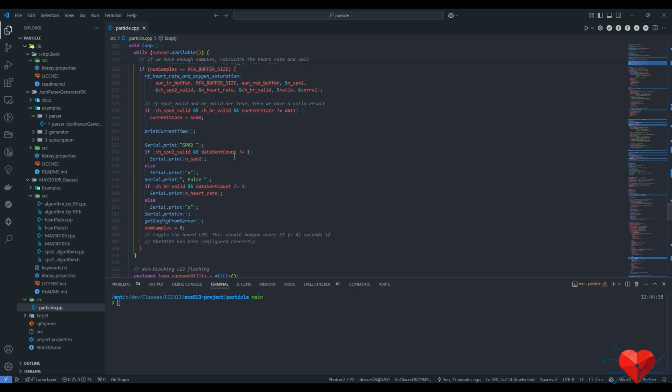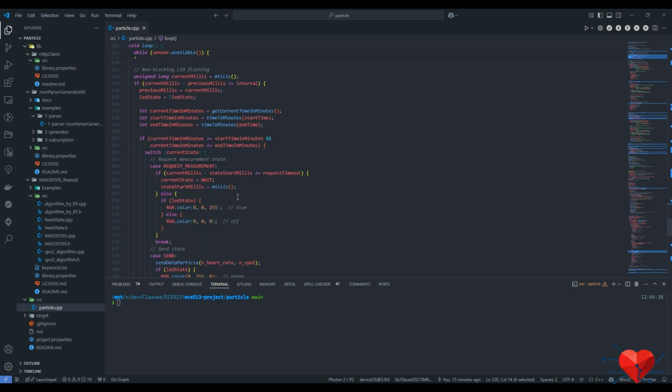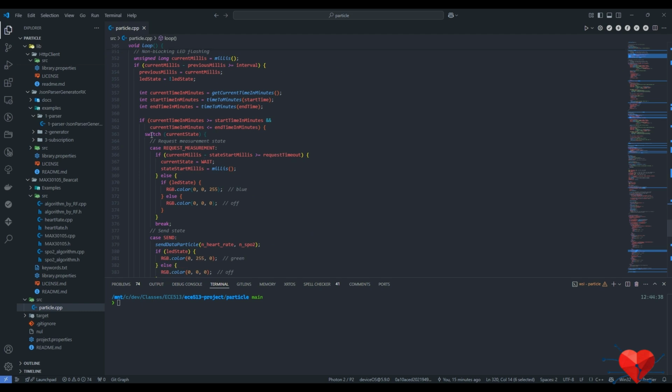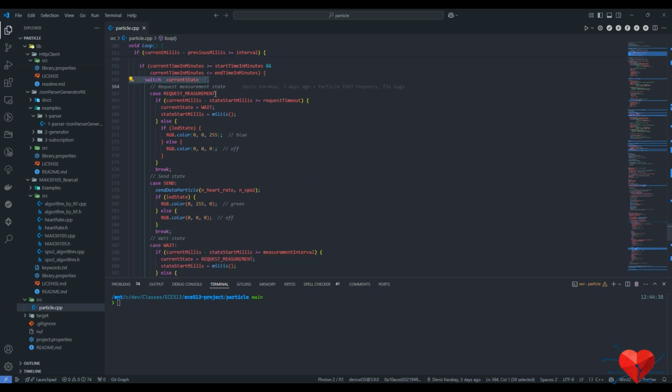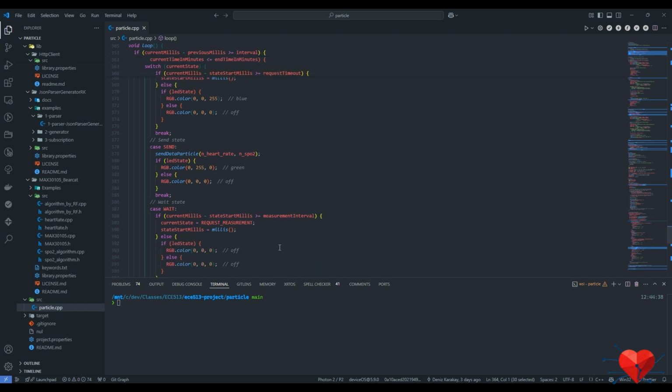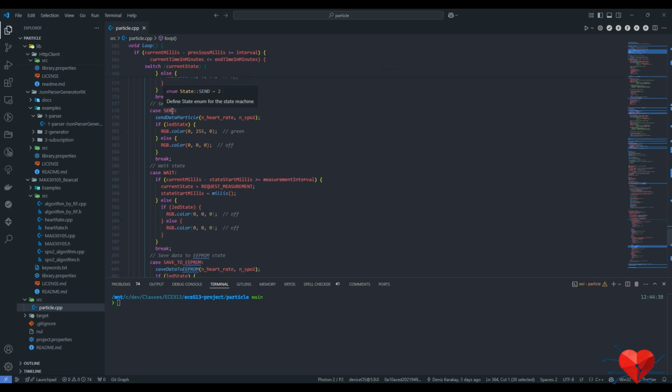So we are getting those data and printing them out here, but our state machine actually works here. So we have this switch case to determine which state we are in. There's a request measurement state, in which we are asking for data from the user. And all those timeouts are for changing the states. There is a send state, in which we are sending the data.